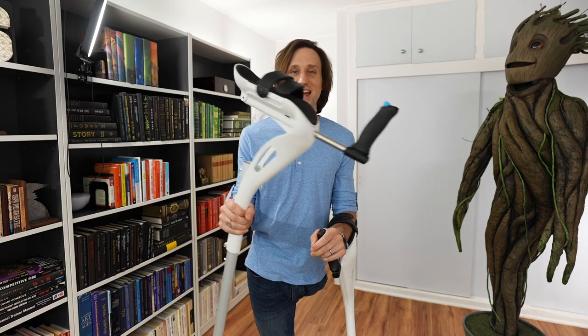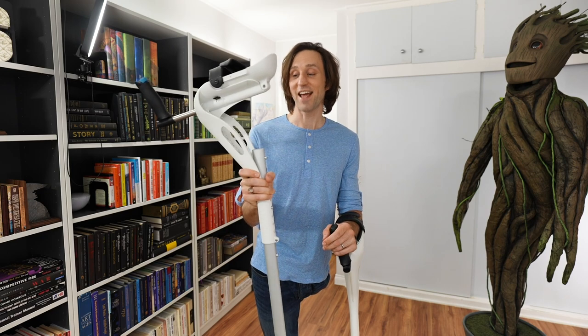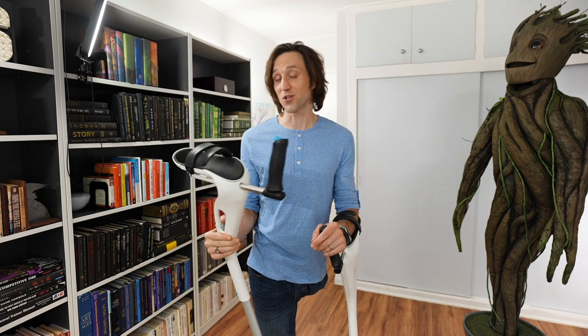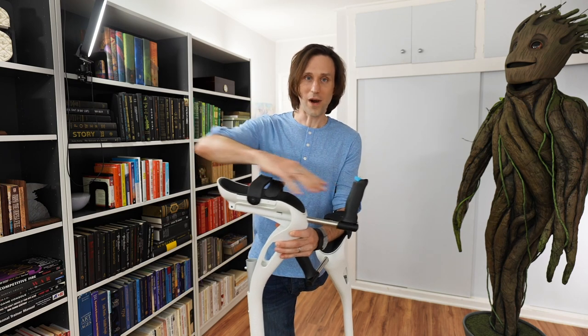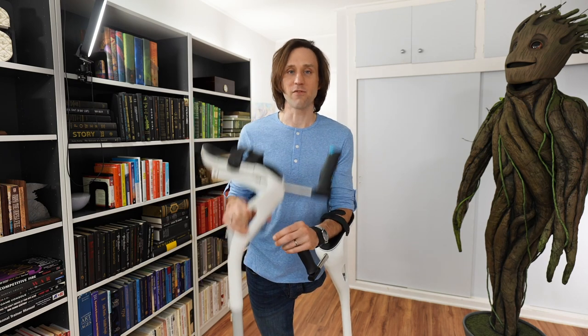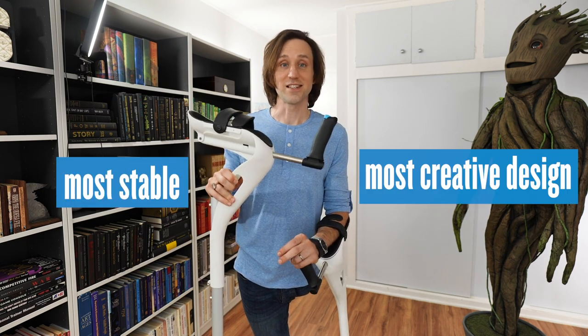Hey internet, Josh Sundquist here to review the MD Crutch — a pretty innovative walking aid. Amongst other crutches, I've tried similar ones that have a forearm weight-bearing mechanism. These are by far the best, by far the most stable, by far the most creatively designed.